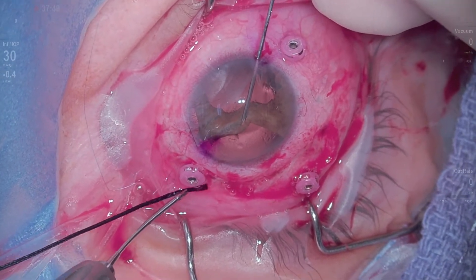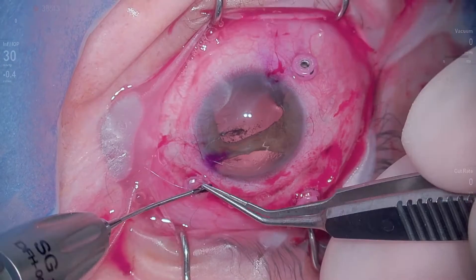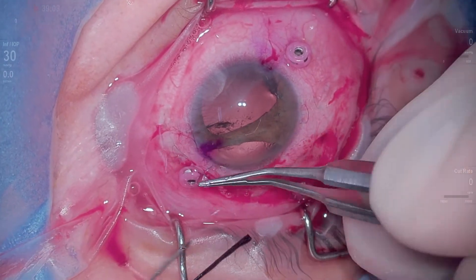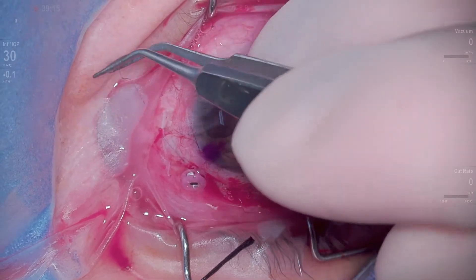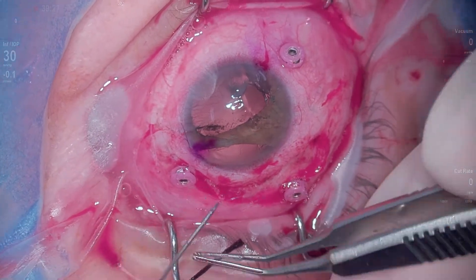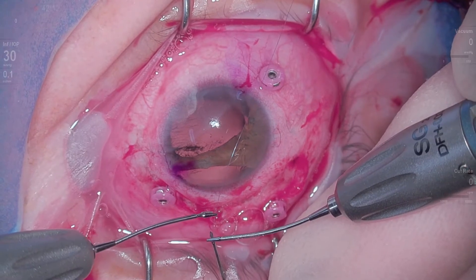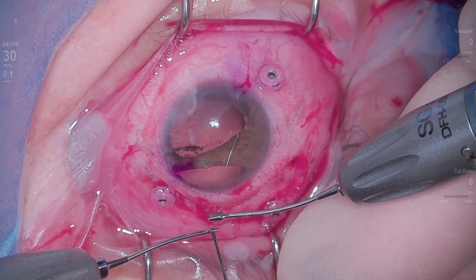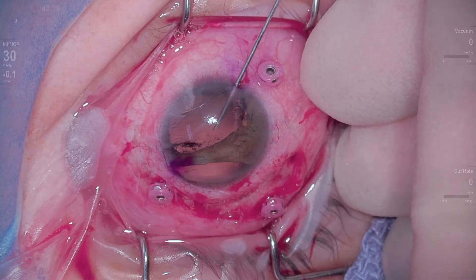I do this again, but unfortunately my proline has come out, so I decided to just go ahead and tie this off. Ideally I wanted to run these all the way across and then tie it to itself. But instead, what I do is take that 2-0 silk and feed the proline under those loops, and that keeps that loop from getting back into the eye.